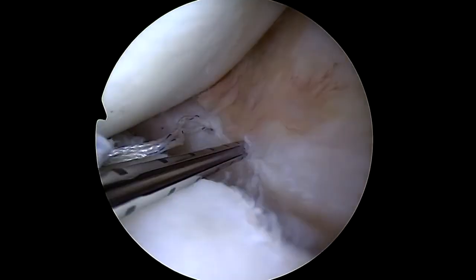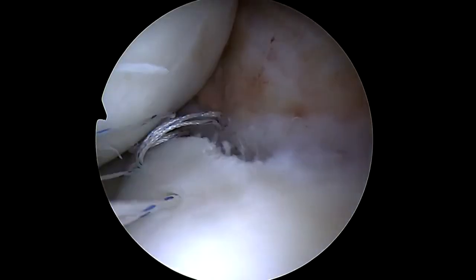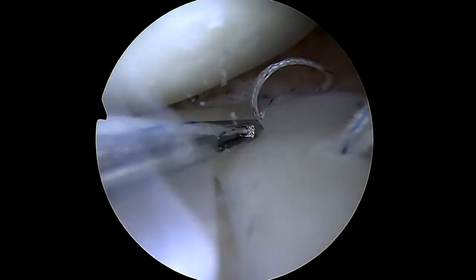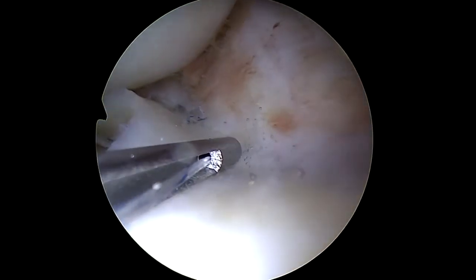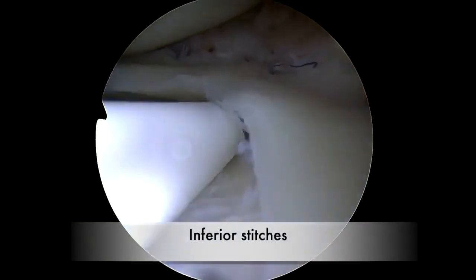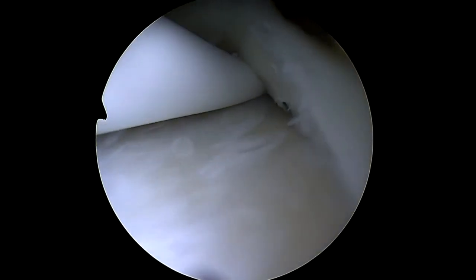Three superior stitches are then successively placed before being tightened one after the other. Once tightened, this top-first technique allows the free edge of the meniscus to lift up. Then the inferior stitches can be easily placed through the inferior surface.